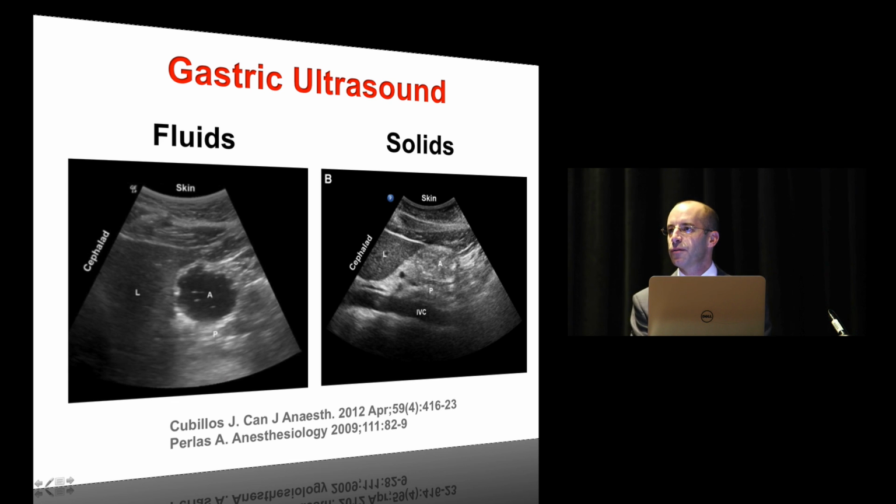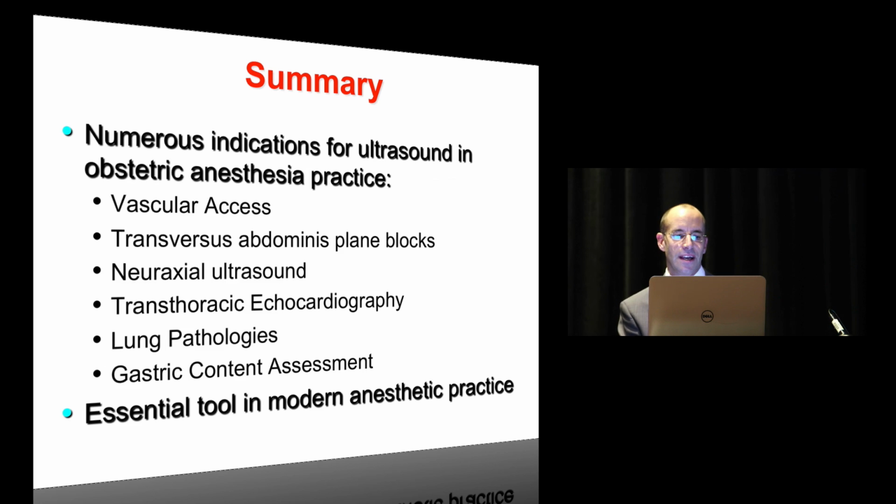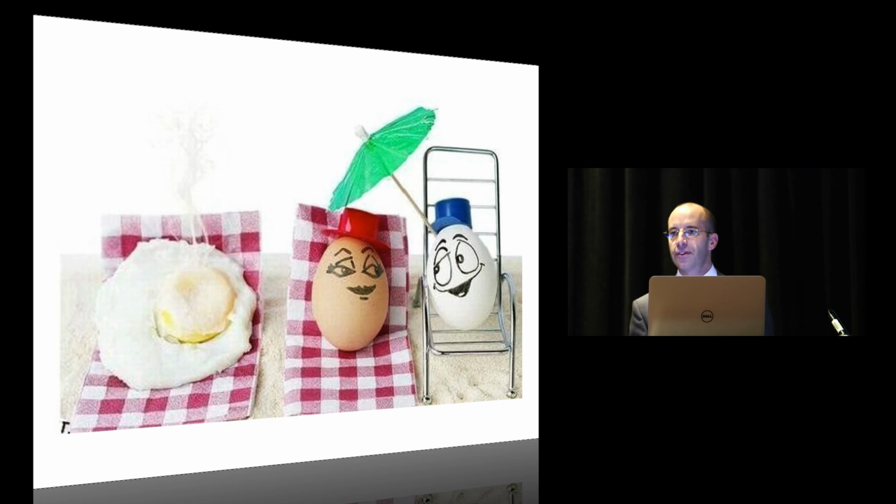So this is still not ready for prime time, but this is the next application of ultrasound. So if you're bored tomorrow on OB, feel free to play around with it. I've gone through various applications. Obviously, each one would deserve a lecture in itself if you were going to actually want to apply it, but it's very easy to actually pick up these techniques with the exception of TTE, which is going to require more concerted, focused effort. And I hope that you consider applying some of these in your clinical practice to improve your patient safety and various other things.